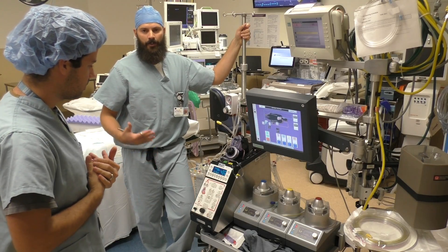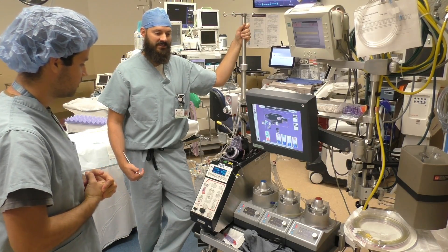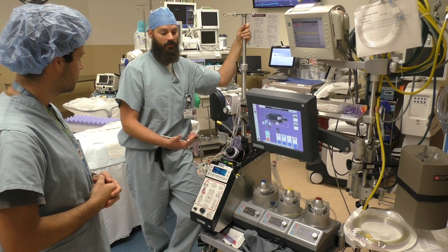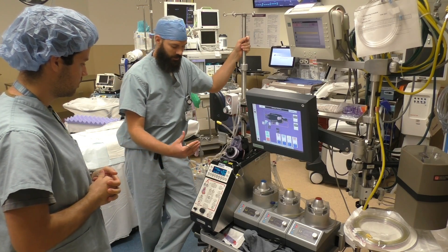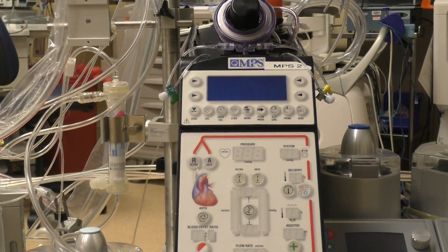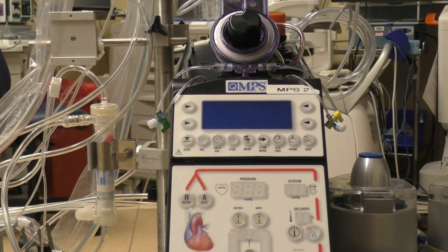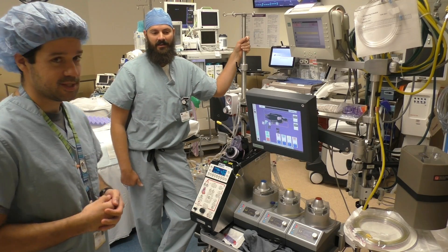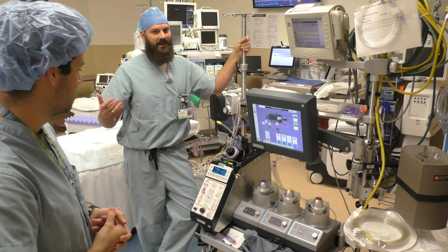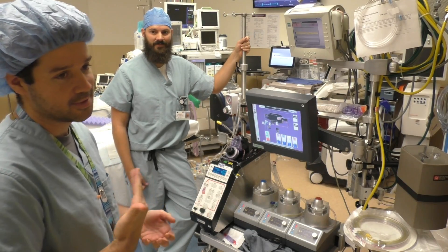So now we're successfully on bypass. Trying to sew on a moving target is pretty difficult. So in order to facilitate an easier surgery, we're able to arrest the heart — take a beating heart and cause it to be completely still so the surgeon can work on it. The way this works, we've been handed off another tubing, and we're able to infuse potassium — kind of like the lethal injection — down the coronaries, causing the heart to arrest. It's pretty interesting to watch on our monitors because you get to see everything go flat. Anywhere else in the OR everyone would be freaking out and CPR would be initiated, but we actually have to stop the heart in this room to be able to work on it.